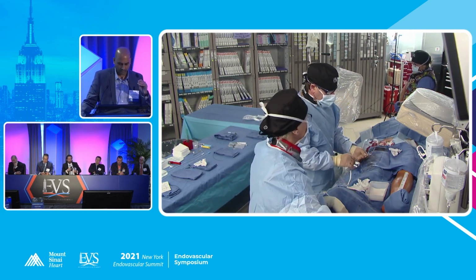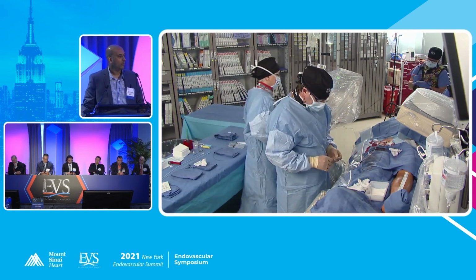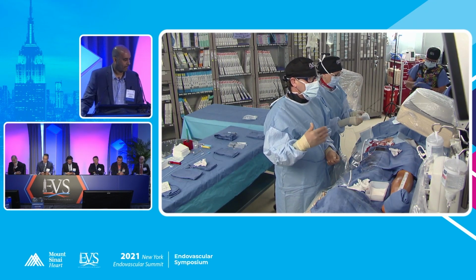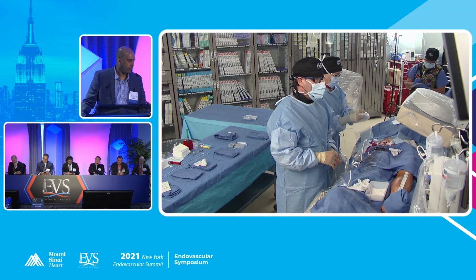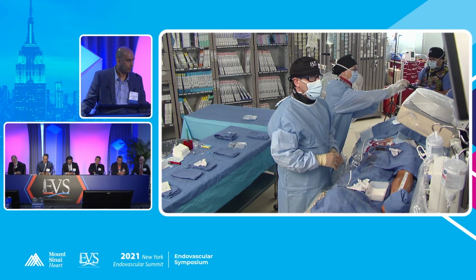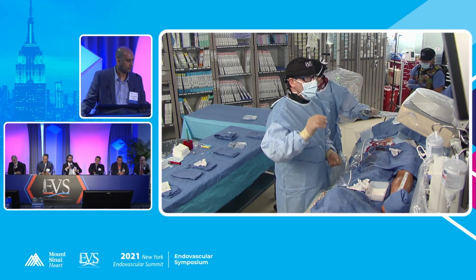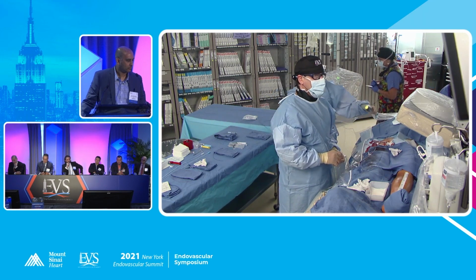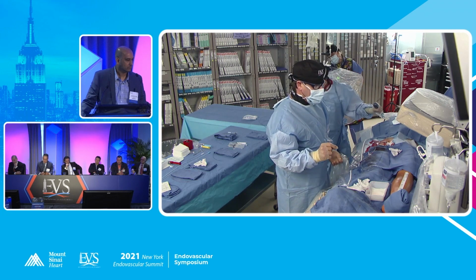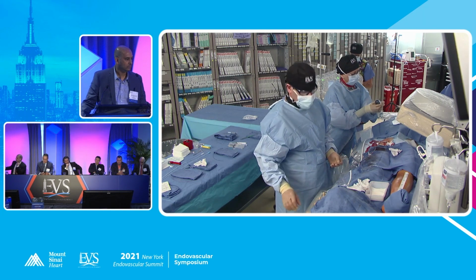So our plan, having intertwined the 29 opinions into what we're going to try to do, is to Shockwave with a 7x60 in the common femoral artery. We'll probably take a Shockwave 2.5 or 3.0 in the distal PT, see how we look. We'll then probably place a drug-eluting stent if we need to in the posterior tibial artery, and then DCB with a big DCB in the common femoral artery, and then a provisional Supera stent, if that sounds okay. That sounds like a great plan.